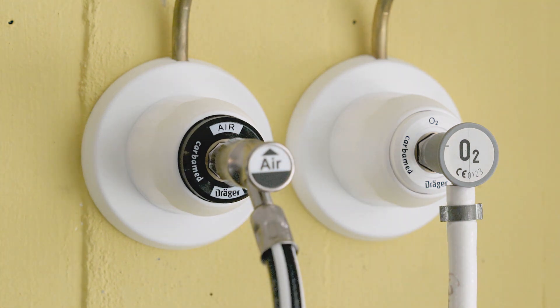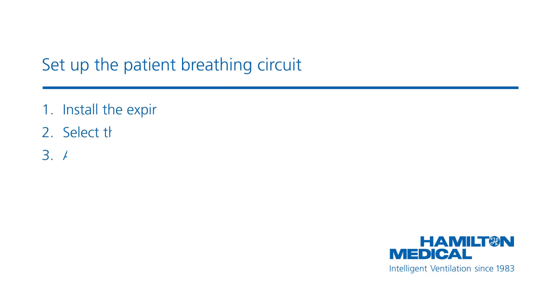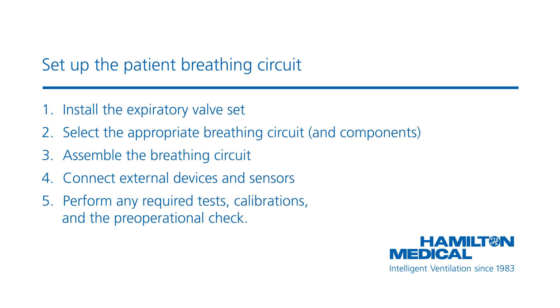To connect the breathing circuit, do the following. First, install the expiratory valve set. Then, select the appropriate breathing circuit and components. Third, assemble the breathing circuit. Then, connect the external devices and sensors. Finally, perform the pre-operational checks.